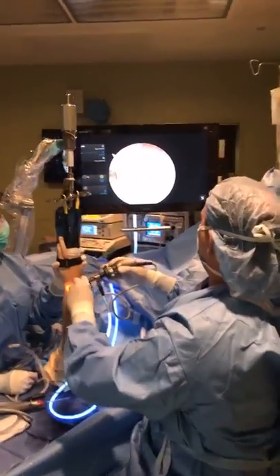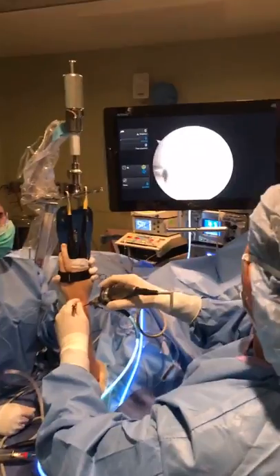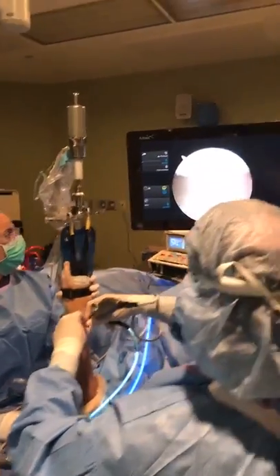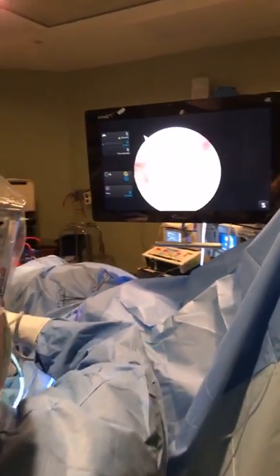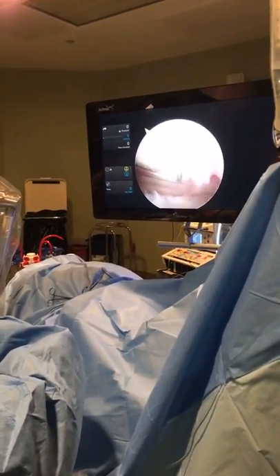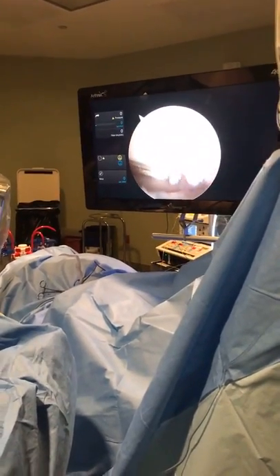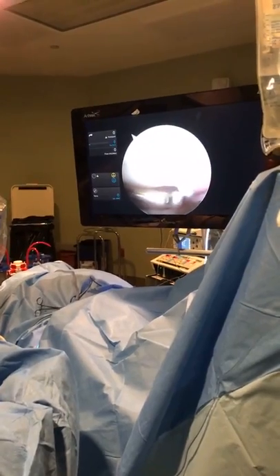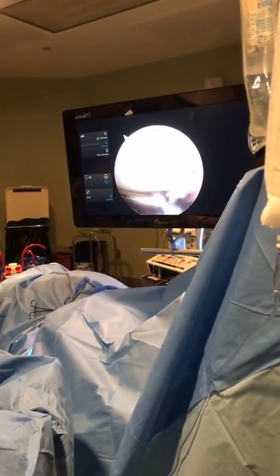So I'll tell you what, before we repair that, we're going to look in another part of the wrist, what we call the midcarpal joint. Now he's got a little bit of fraying here. This is called the scapholunate ligament. So I'm going to have to definitely look at that. But I look at that from the midcarpal joint. Okay, get a picture of that, please.